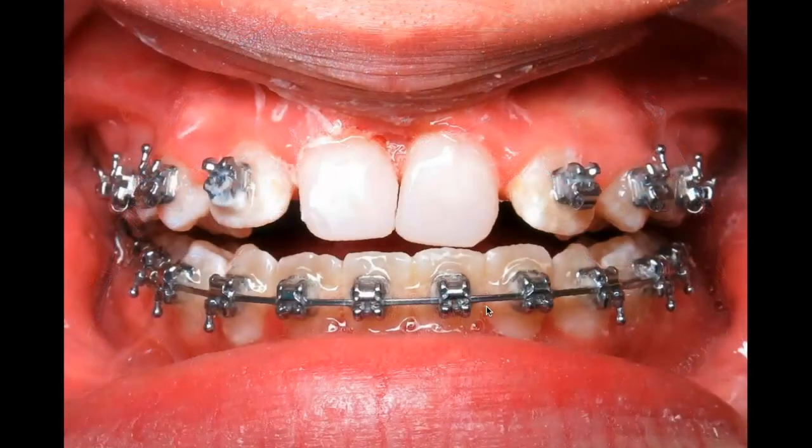Now, I do my own temp bondings in the office because it's really, really hard to communicate what needs to be done on a temp bonding, and dentists tend to just make everything look straight and fill spaces, right? Which is not what we want orthodontically. We want the right size, width, and angulation of the tooth so we can continue to straighten it. Obviously, these teeth aren't straight, so they were running into each other, so we had to bond it in a way that this angulation was maintained so I can remember where the root is without having to take an x-ray every visit. But our height and width is good. So that's how we bonded those.